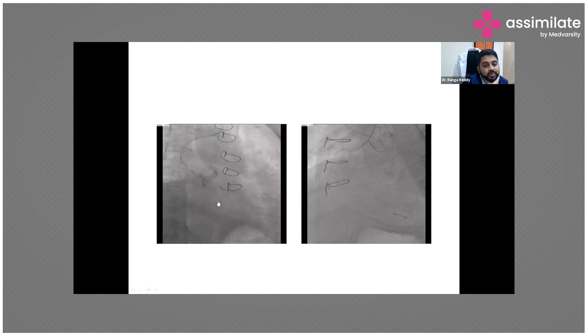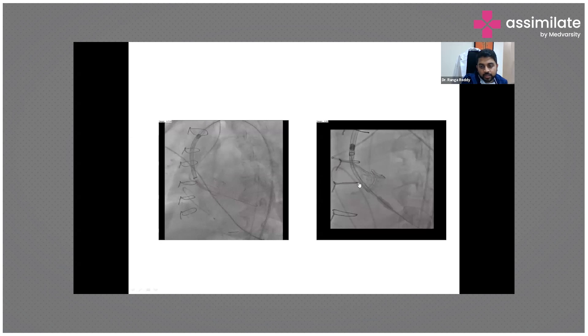This is a case where a surgical aortic valve replacement was previously done with a bioprosthetic valve, which subsequently degenerated. So we performed a valve-in-valve procedure — there is the previous surgical valve frame, and inside that we deployed another valve. Because the coronary height is small, we protect the coronaries by engaging them and placing a wire inside, so that if any obstruction occurs, intervention remains possible.